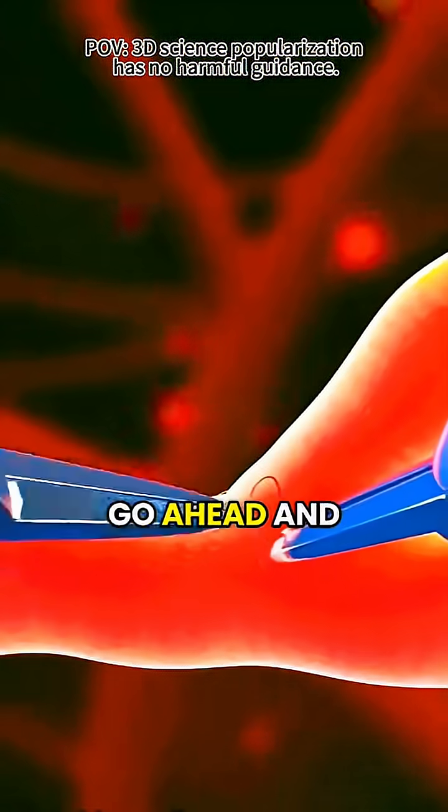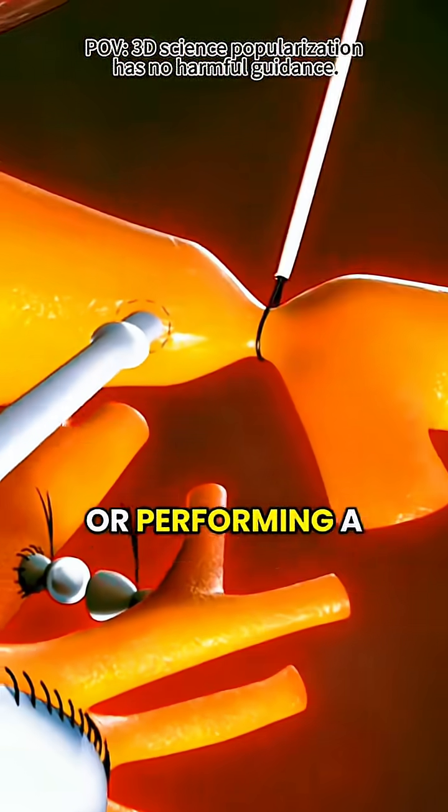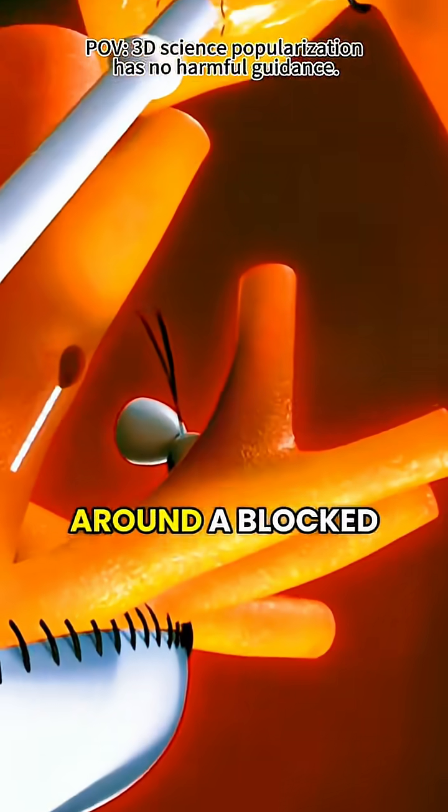With that support in place, the surgeon can go ahead and fix the issue. That might involve repairing or replacing a damaged heart valve, or performing a bypass to allow blood to flow around a blocked artery.